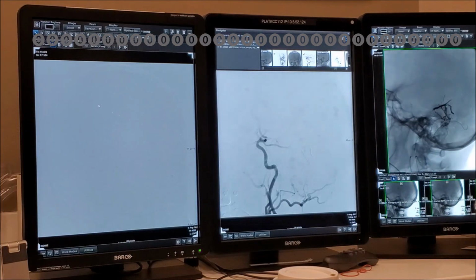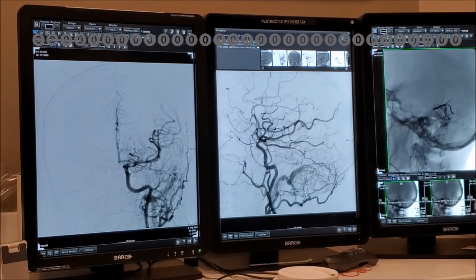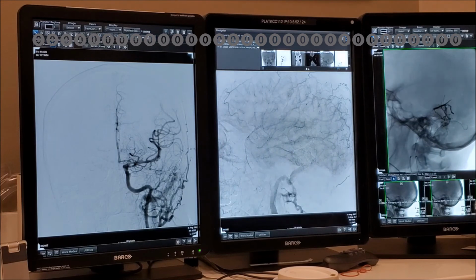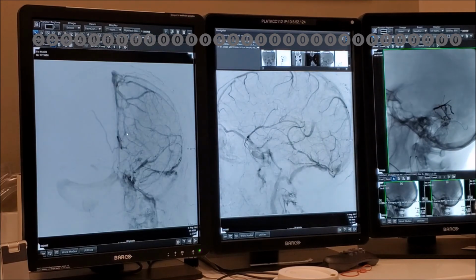Let's see, what I dumped for a branch. So you're going to come back? Yeah, it'll be a second stage. But if you look at that run as it plays through, I think you can actually start to see normal cerebral venous drainage antegrade through that sinus now, mainly on the AP projection. Yeah, you're right. So there is some restoration of normal sinus flow.